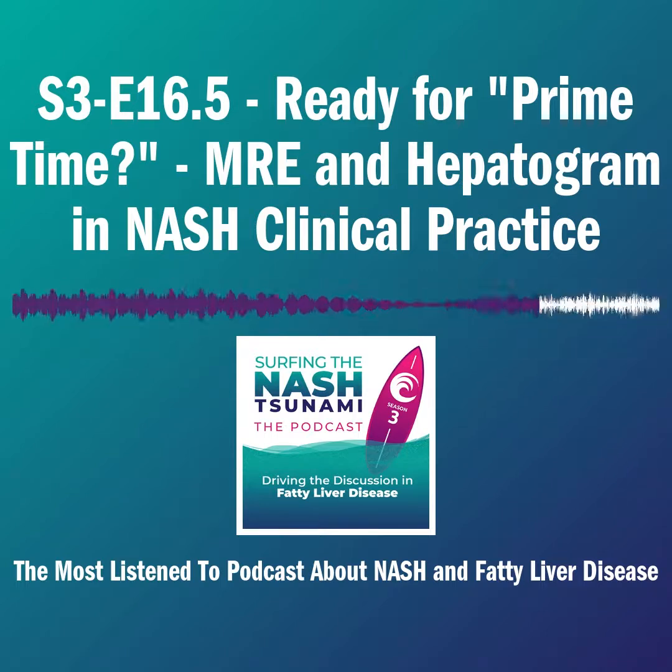Then based on Alina Allen's work, we could have some idea of who's at risk for progression to liver-related events. And I'd call them back if they have high liver stiffness for more monitoring. But otherwise, if they have a low liver stiffness value at baseline, let them go and have them come back in years later. Looking forward, it'd be great if we have a drug approved to treat non-alcoholic fatty liver disease. And instead of screening with biopsy, we could screen with these non-invasive tests, whether that's MRE, PDFF, and some other additional blood tests or what that looks like. But then we could have both identify who could benefit from this treatment and also monitor their response.